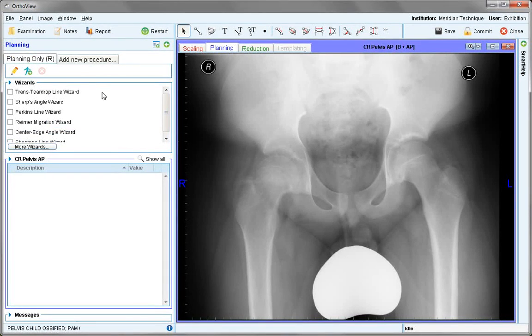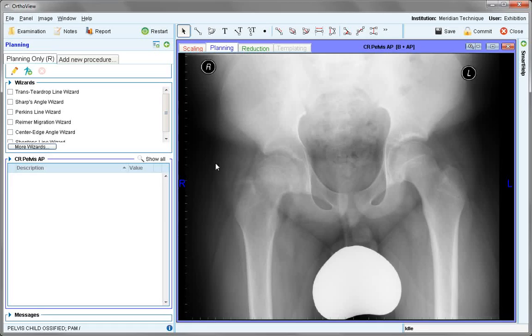We're presented in planning with a set of wizards appropriate to the bone age of this pelvis, as certain bony reference points will be used that are not available in the non-ossified pelvis.